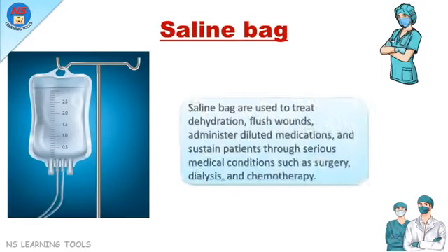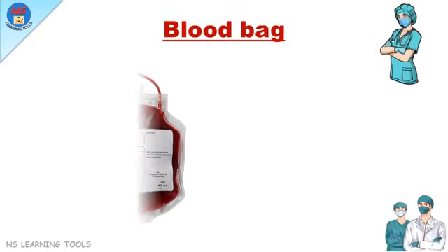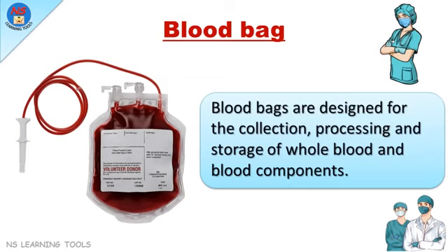Saline bag. Saline bags are used to treat dehydration, flush wounds, administer diluted medications, and sustain patients through serious medical conditions such as surgery, dialysis, and chemotherapy. Blood bag. Blood bags are designed for the collection, processing, and storage of whole blood and blood components.